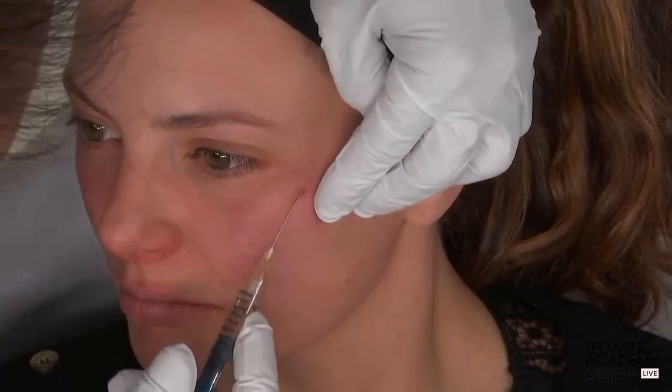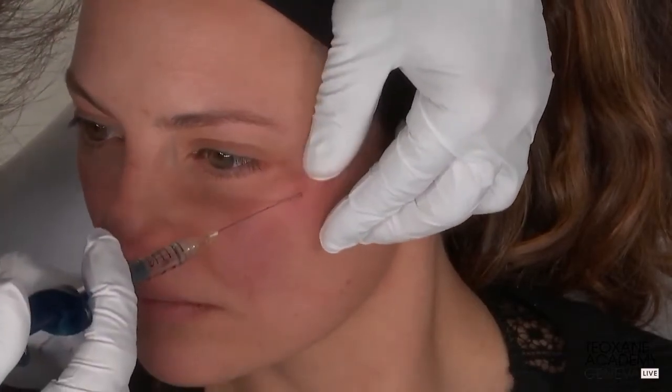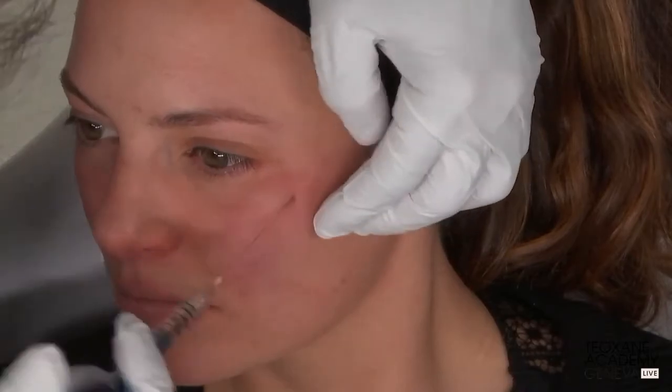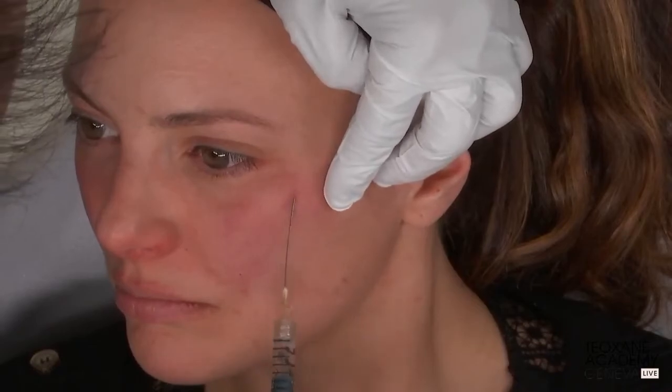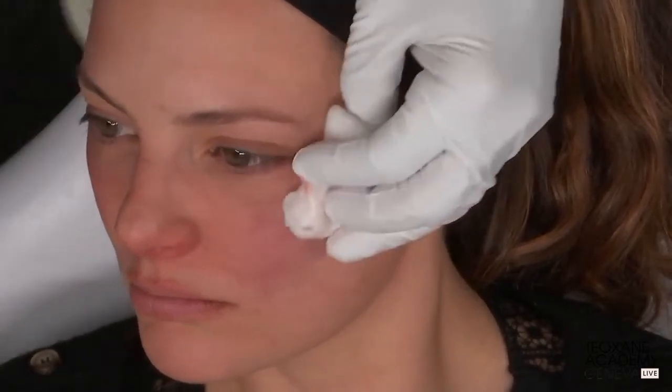So, yeah. You know, the patients nowadays have incredibly high expectations. They expect to be able to go out with their friends tonight and look better already. So tomorrow they want to. Yes? Francesco, here you did something different from the others. Yes, I'm taking advantage of being distracted by the audience. I'm just playing around with the elongation of the zygomatic arch by projecting it higher, like past the G point.